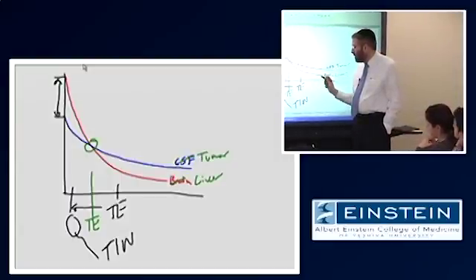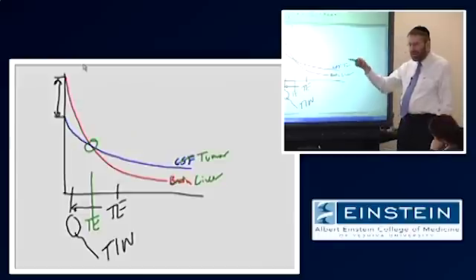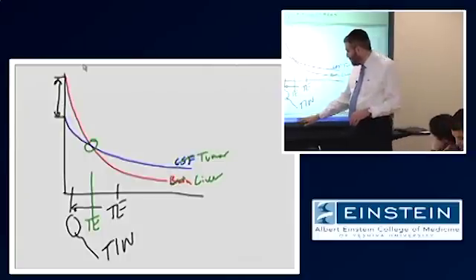So one of the nice things is that simply by repeating the same exact imaging approach and changing this one parameter, we can dramatically change the contrast of the image. Okay, let's look at an example of that.